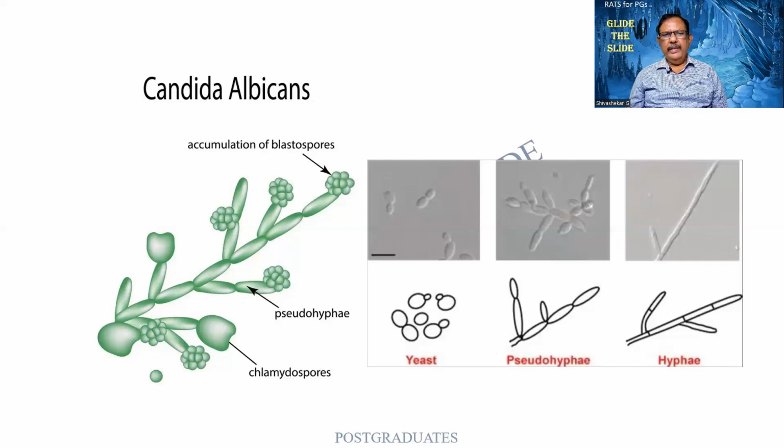But if things go on all right, if it happens to be a culture medium or immunosuppression, then there can be a true hypha that can grow, which can again accumulate the blastospores. So for any such organism, there are two modalities of division and multiplication. One can be the spore form, another one can be the pseudohypha. And when these spores get lodged elsewhere, they will form the yeast forms. And if congenial conditions prevail, it will grow into a pseudohypha and the story gets repeated. So the diagnosis has to be Candida species.